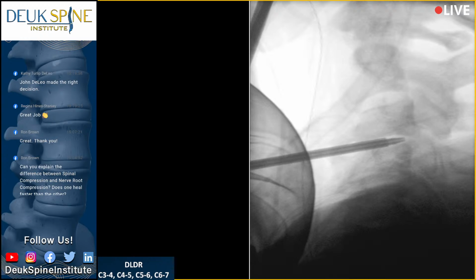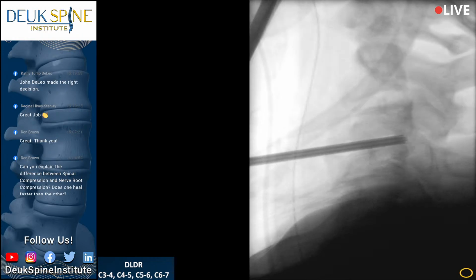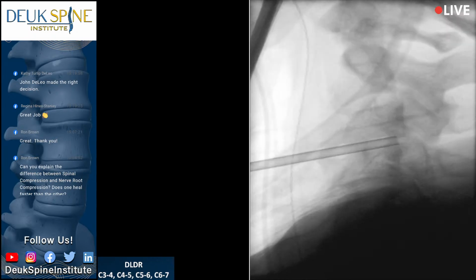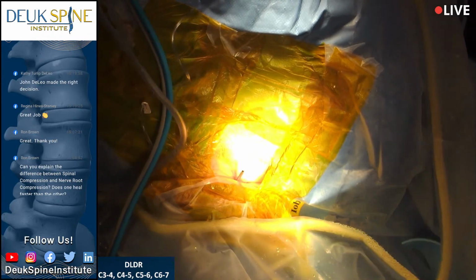The key is the tube has to slide over it. You ready? Shot? Does that help? That's beautiful. That's good? That is beautiful. Done. We're done. Yeah, the more you pull, the easier it is for us. Of course. That's why you do inline traction. All right, that looks really good.